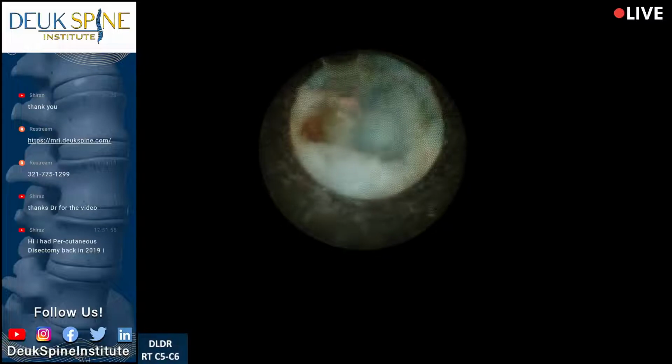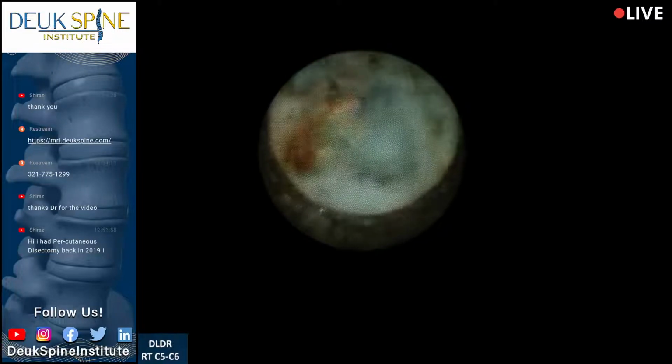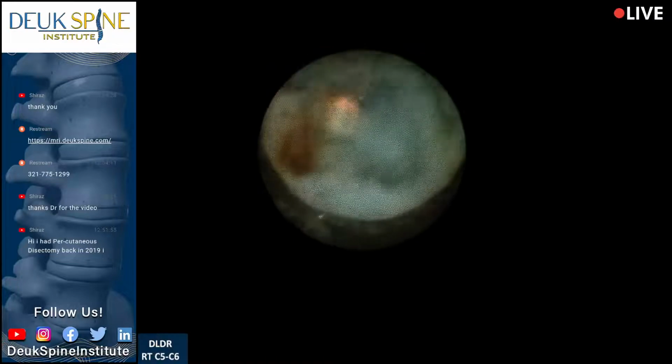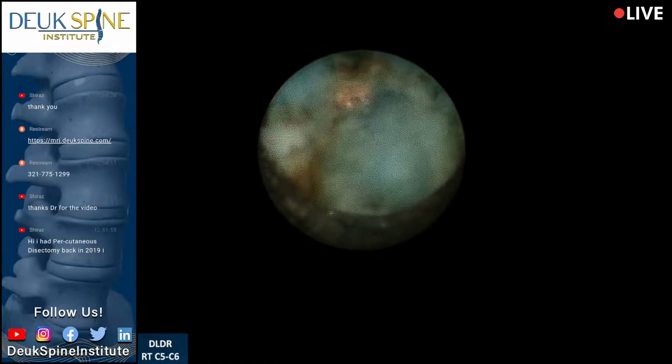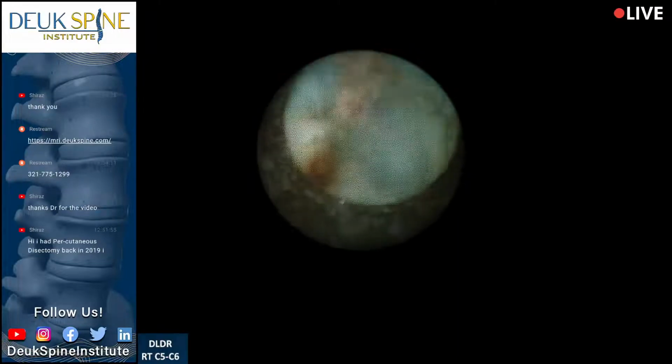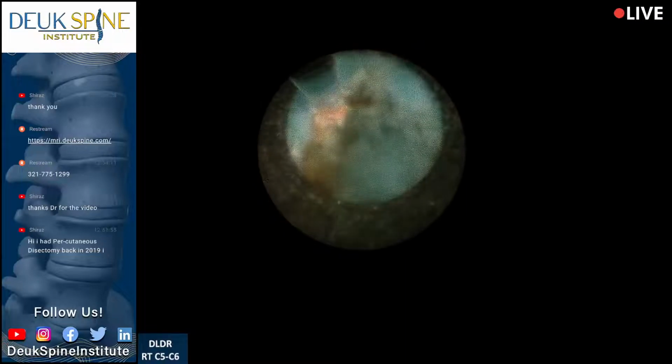Had some really good questions. Any more questions at this time? No current questions. Great. Well, let's show our audience, if you're thinking about having a fusion done called an ACDF, let's show you why you shouldn't.